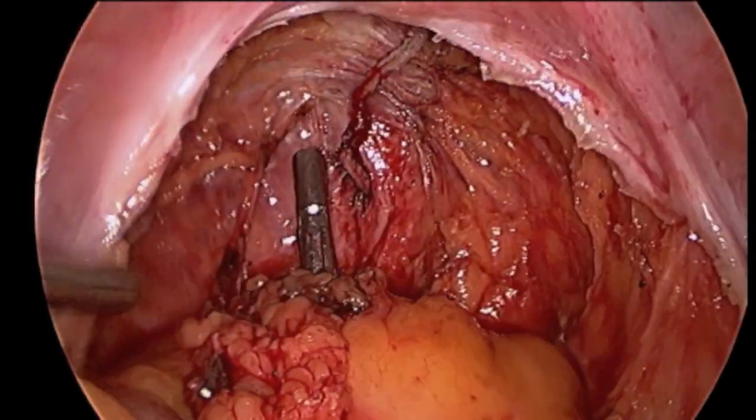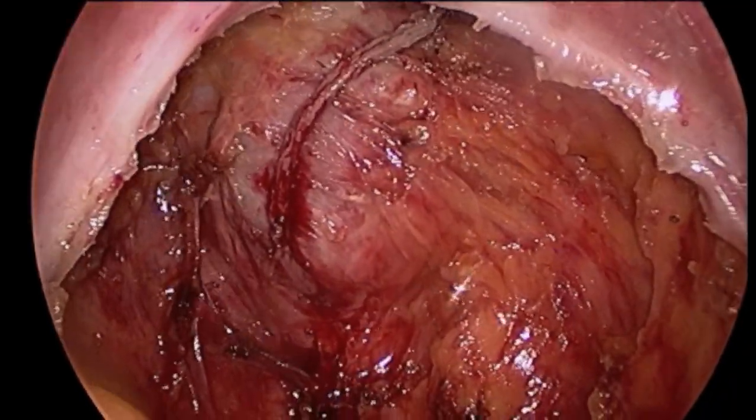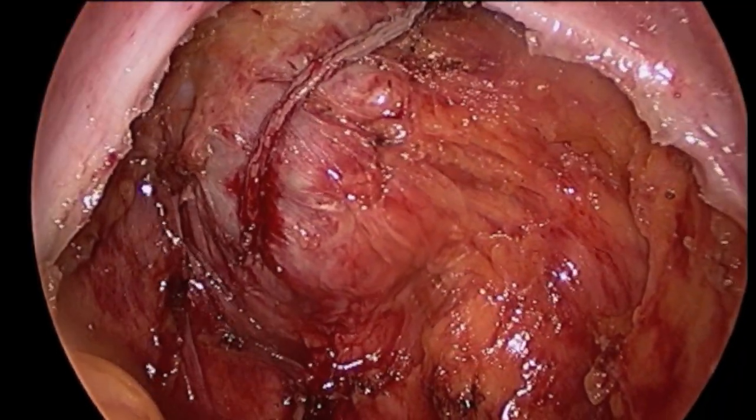At this point, the anvil has been secured, the wound closed, and laparoscopy resumed. The surgeon checks to see that the anvil will easily reach the remaining rectum.